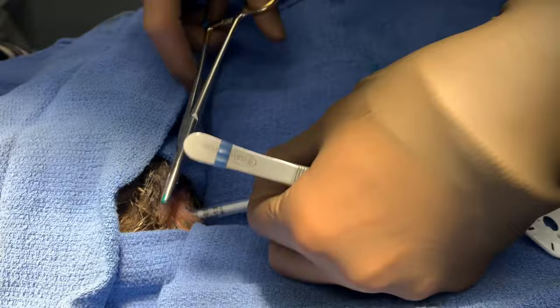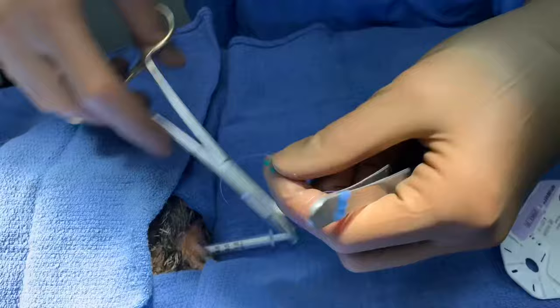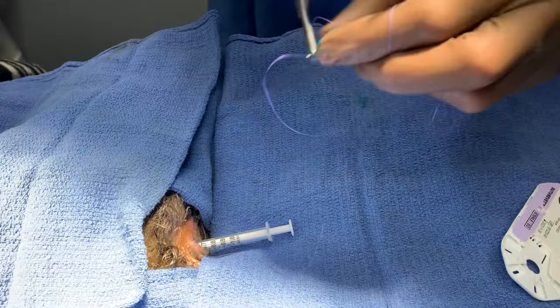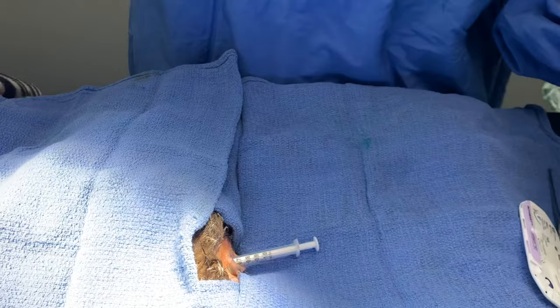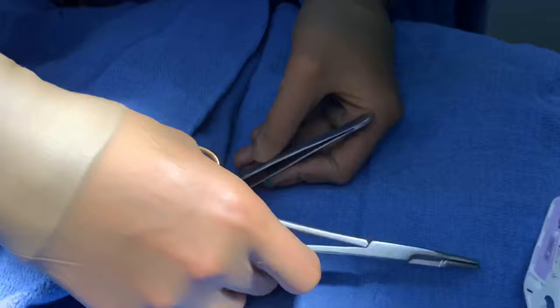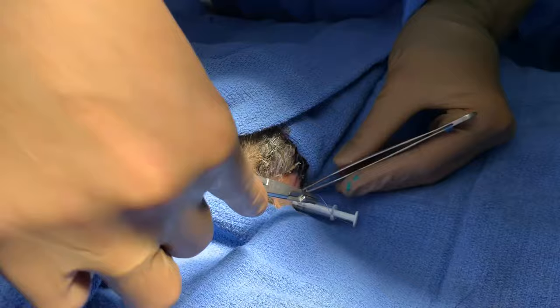We use some Vicryl here. You can use a lot of different stuff, but I like Vicryl that way in case I can't get it all out, it will dissolve over time. And then we're just going to go around in a circle — it's pretty easy to put in a purse string. You're basically just cinching the butt closed.